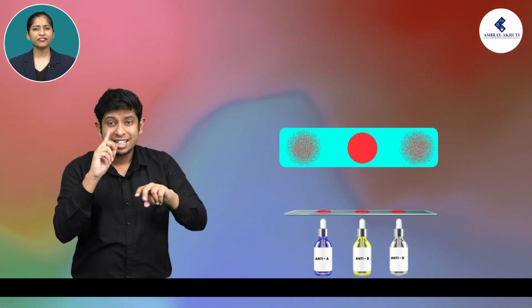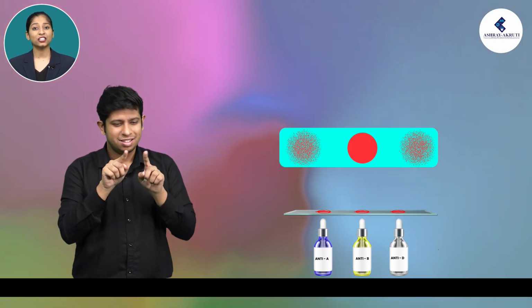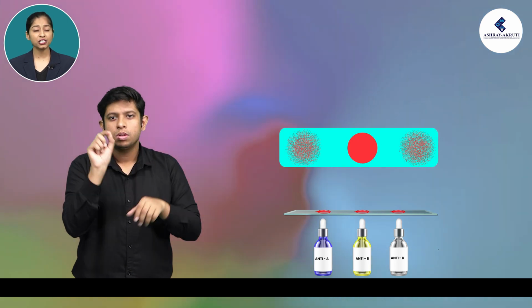Watch to see if any of the samples show agglutination. The agglutination will appear as grainy clumps of red blood cells, RBCs, suspended in a clear solution. Note: Rh is slower to agglutinate.